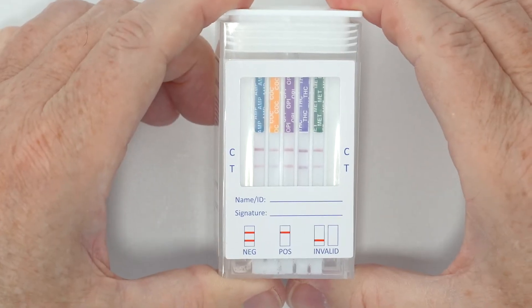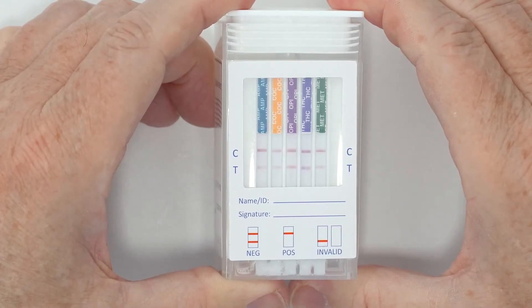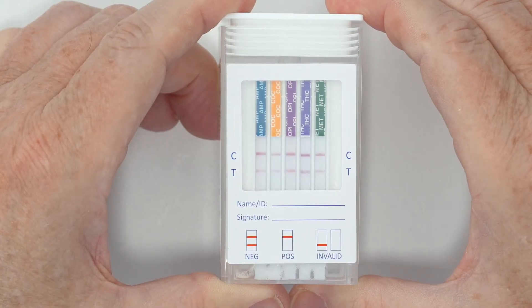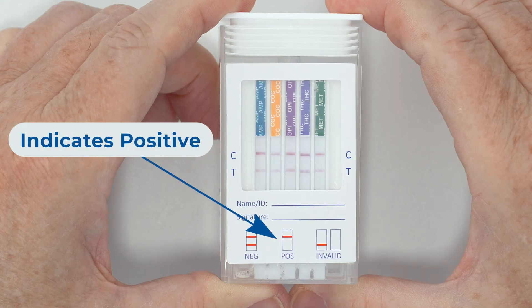When determining results, if the specimen contains more than the predetermined cutoff levels, the result is positive for the corresponding drug of that testing zone. This is indicated by one colored band in the control region. Positive results may be sent to a toxicology laboratory for further confirmation if desired.